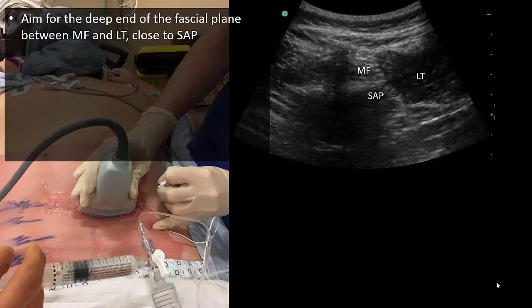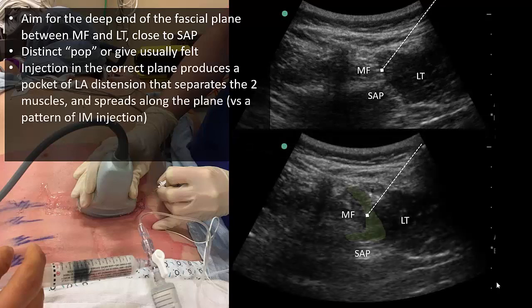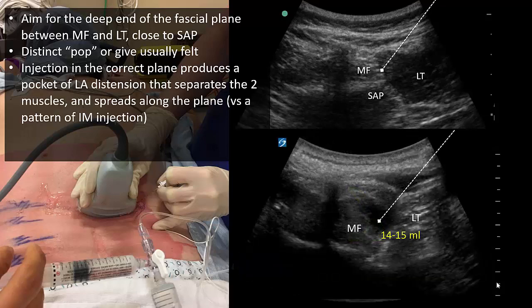After local anesthetic infiltration, insert the block needle towards the deeper end of the plane between multifidus and longissimus, close to the superior articular process. Entry into this plane is often signaled by a tactile pop or give and is confirmed with hydrolocation. An expansile pattern of spread traveling up and down along the plane will be seen. This is quite different from intramuscular injection in spread. Inject 14 to 15 ml of local anesthetic into this plane.